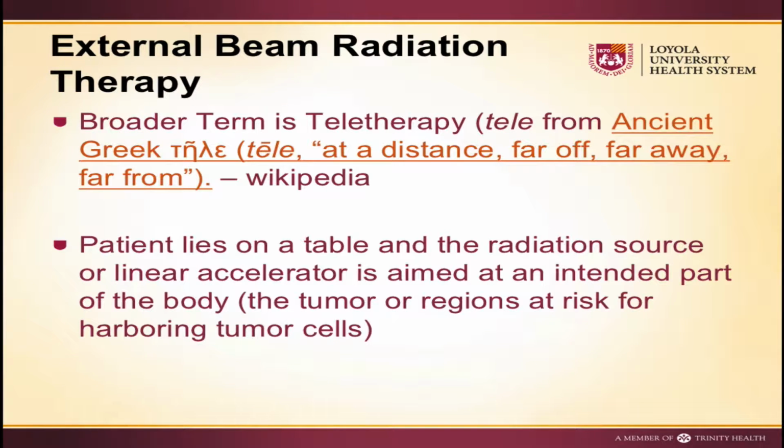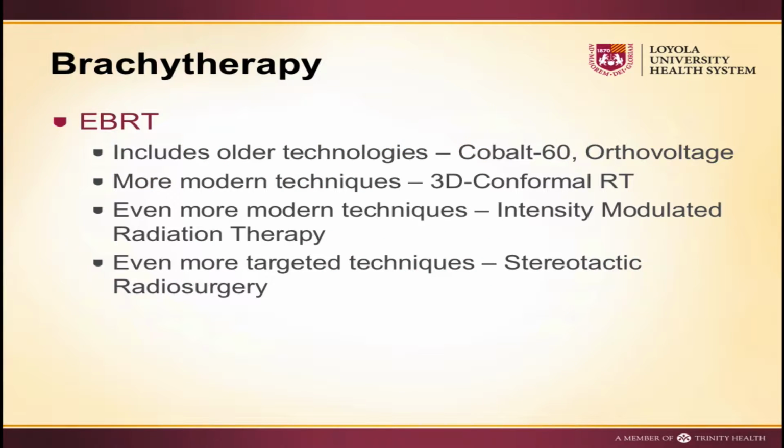External beam radiation therapy is also known as teletherapy. It essentially is any treatment of radiation therapy from a distance. So if you're picturing a patient getting treated, the patient is lying on a table, there's a treatment machine that goes around the patient and hence delivers the treatment.